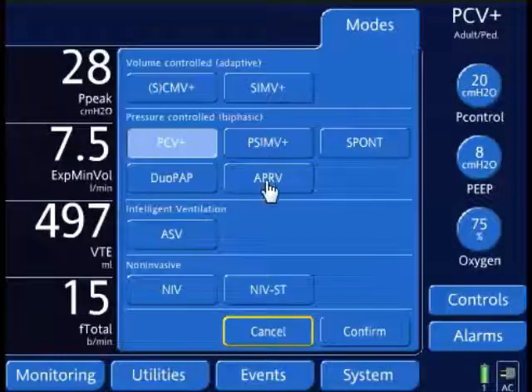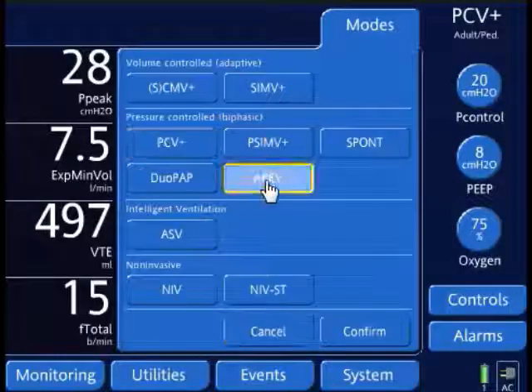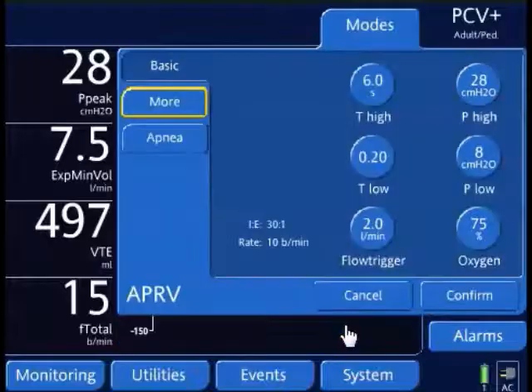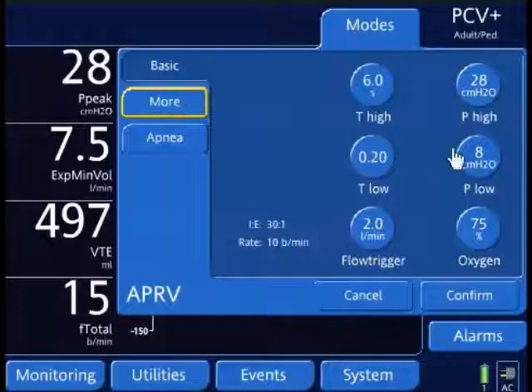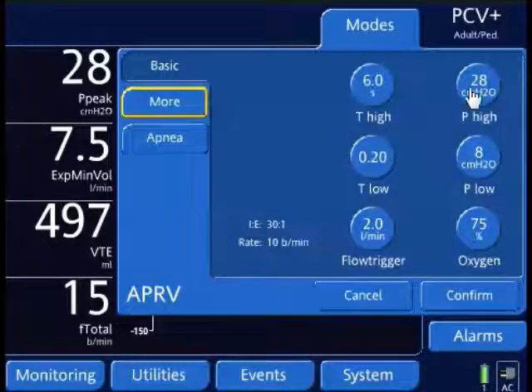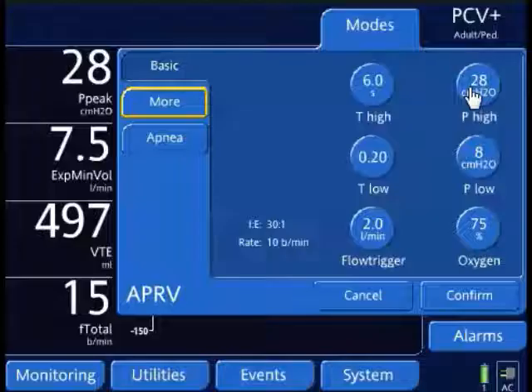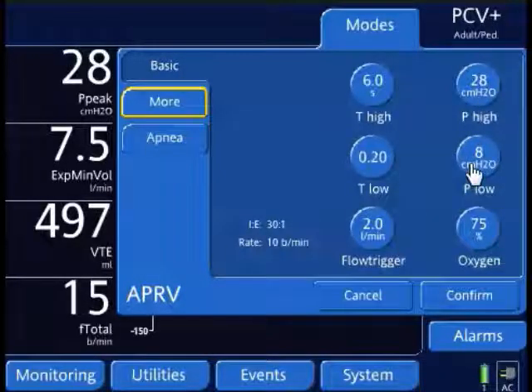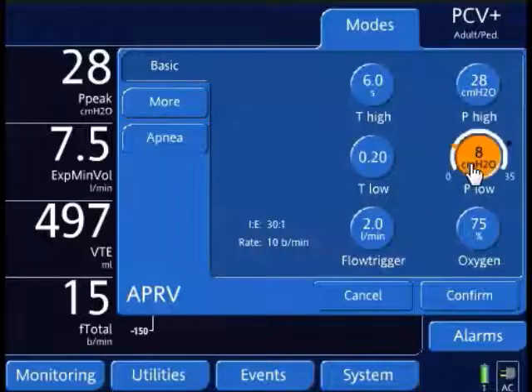I'm going to go to airway pressure release ventilation, confirm it, and that brings up my settings. I have a P-High of 28, and it transferred over some of my settings. P-Low I'm going to change to 0.